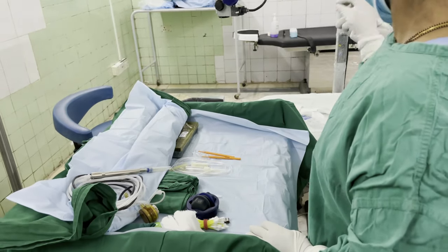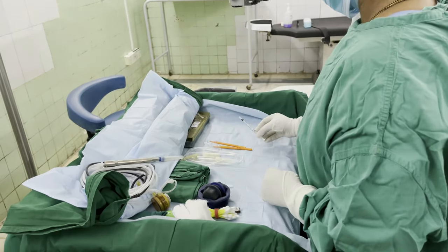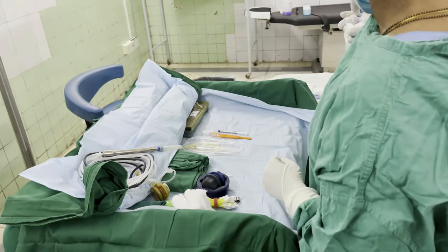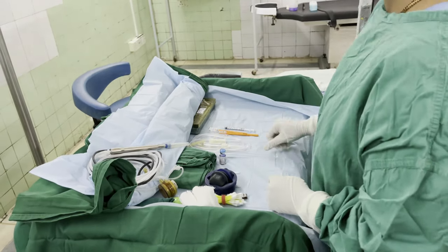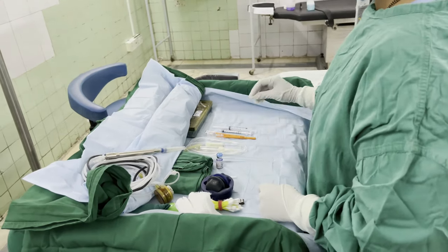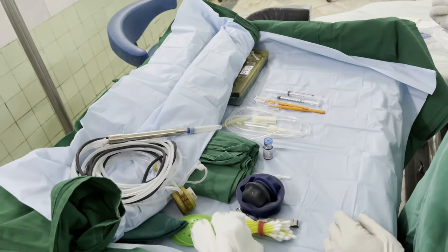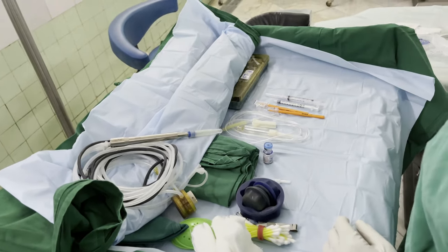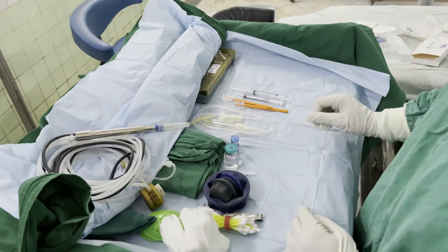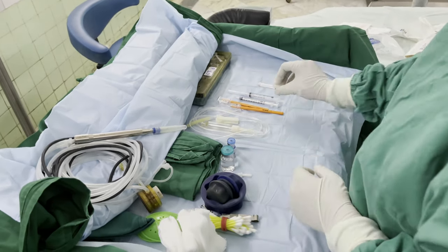The various syringes that will be required either for the blue dye as well as for the hydro dissection and delineation procedures, the stromal hydration, as well as for just keeping the cornea moist during the surgery are now taken. This is the viscoelastic, and now sister will demonstrate how she actually draws the viscoelastic and keeps it ready for the particular case.